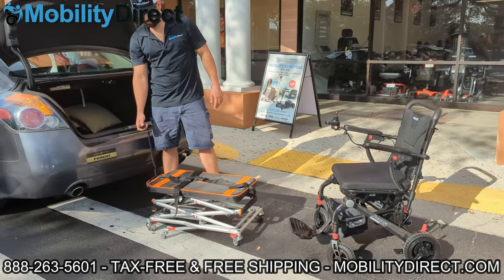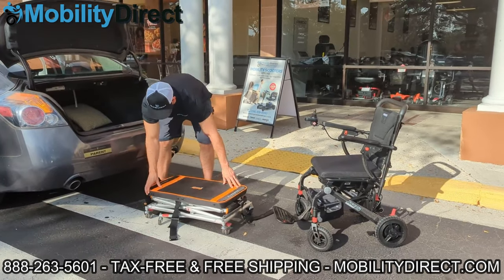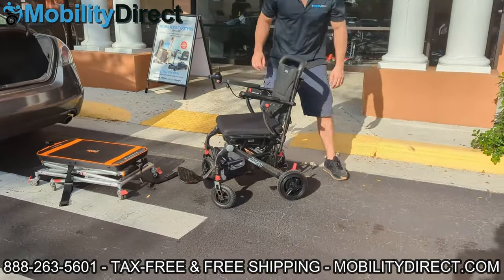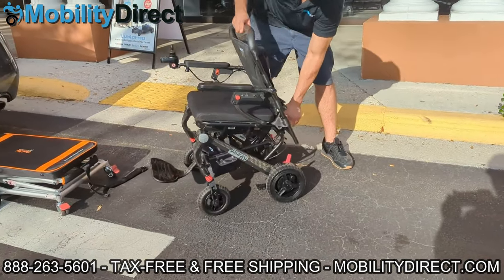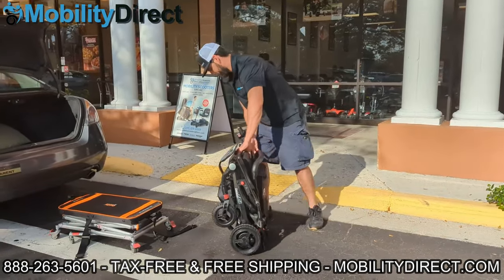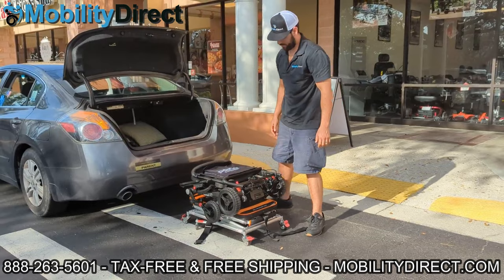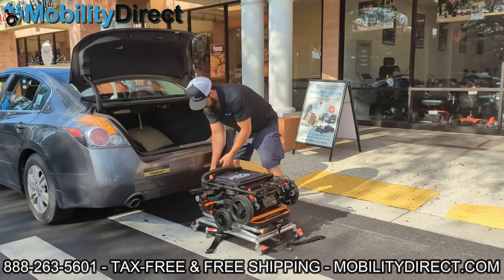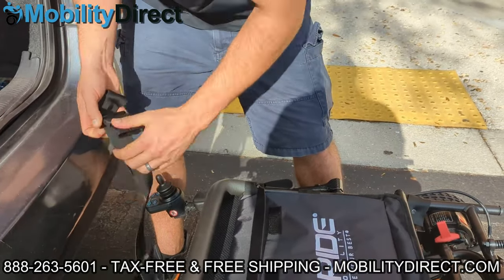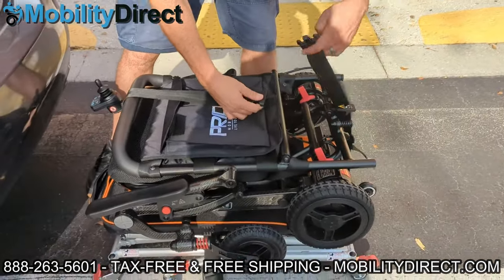Lowering the lift back down — as you can see, across the top there's a set of two straps with buckles that you can use to secure your mobility product to the platform. The platform width is about 18.9 inches and the length is 29.5 inches. Your mobility product can be a little bit bigger, just make sure it's not going to extend past the width of the platform by too much. Here we have a Pride Jazzy Carbon folding power wheelchair, which does not exceed the 100-pound weight capacity limitation.